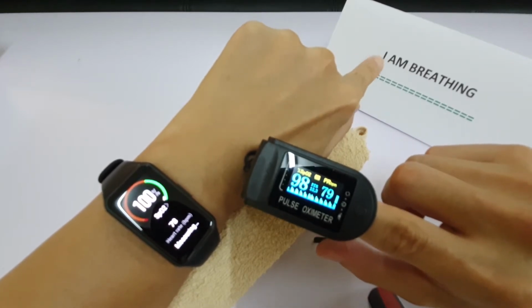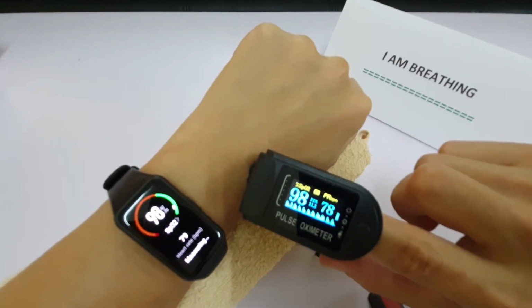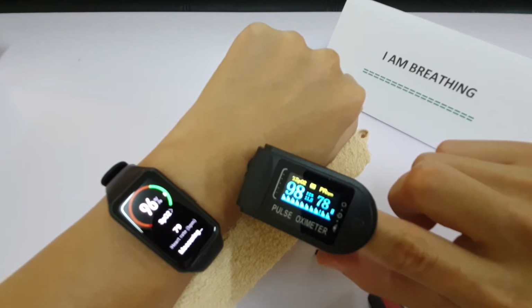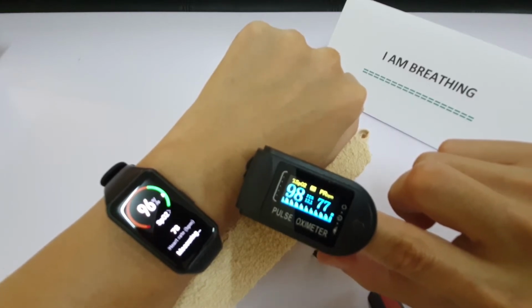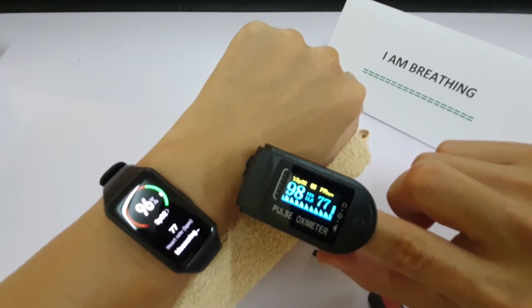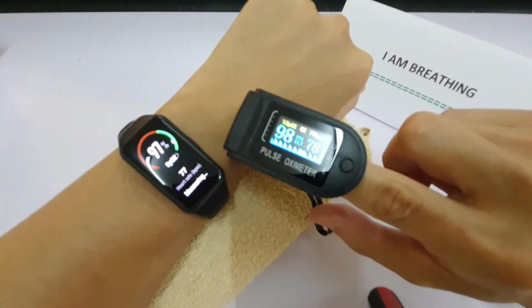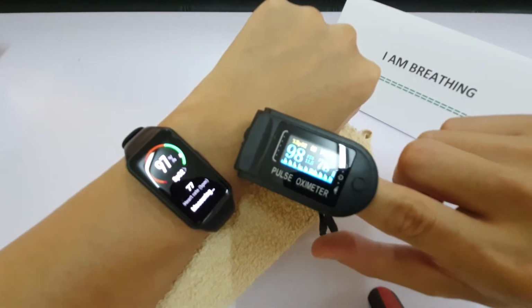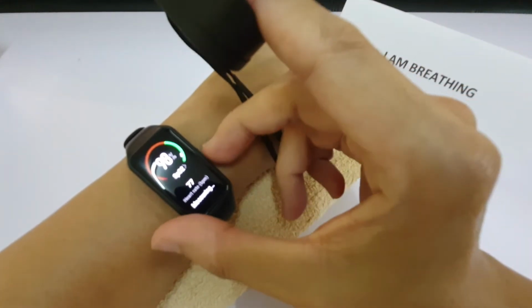Remember that, look out for the sign that I'm breathing. Okay, so right now between the fitness band and the oximeter, it's about equivalent, right? 97, 98 SpO2 versus 77, 78 beats per minute. Okay, it's not focusing very well, is it? I'm not sure why though, but hopefully the actual end video comes out alright. Remember that the band is not continuously monitoring, so let me just start again.